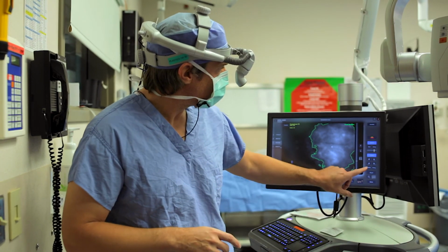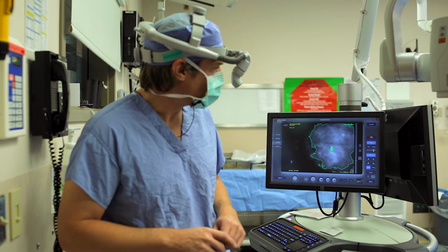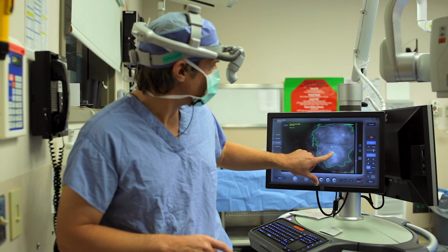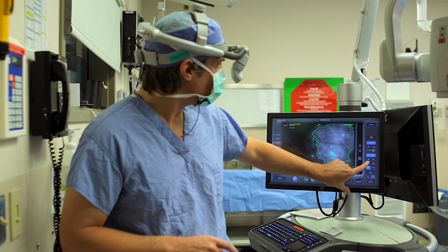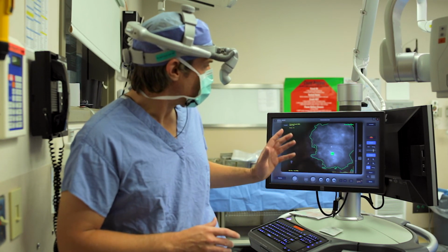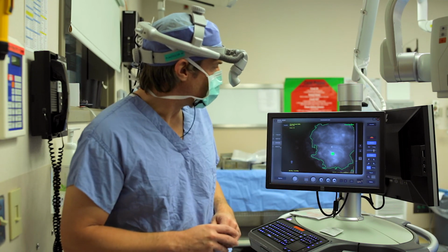The other option is to use a relative value where we can touch 100%. We can move this 100% to an area that's perfused normally, and say, this is 100% perfusion. Show me areas that are 30% or below. So it'll outline areas that are below 30%.